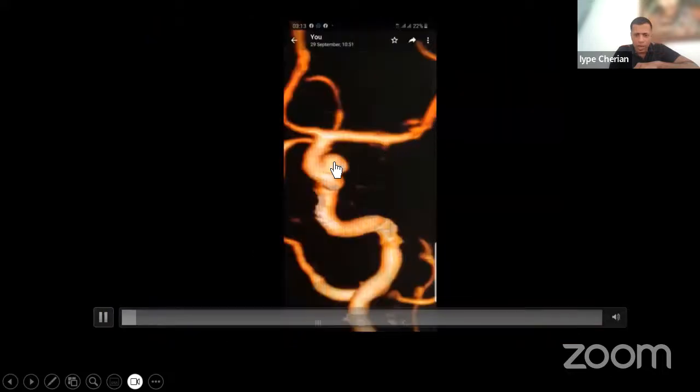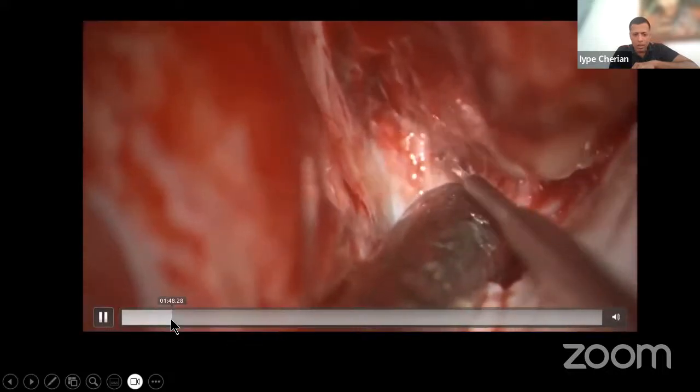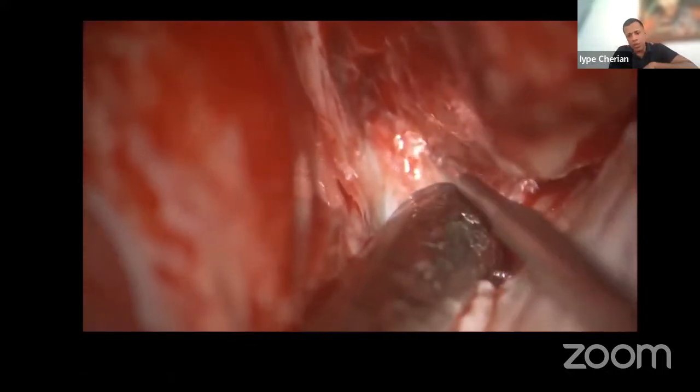And we start with ultra micro neurosurgery with one example from the microscope first. So you can see this is a paraclinoid aneurysm. It is actually transitional, really transitional, because part of it is in the cavernous sinus. This is the clinoid, and that is the aneurysm. And what we are going to do is we're going to take off this clinoid and then cut the distal dural ring, and then so you see the zoom. This is with the Pentero with 40 zoom.